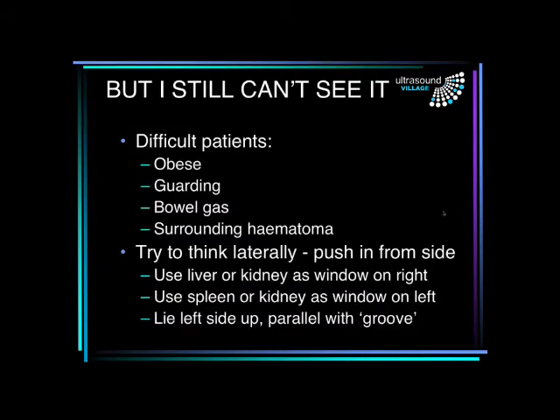Now there are some patients who are very easy — unfortunately, the bigger the aneurysm, usually the easier it is to see. But there are a lot of patients who are actually very difficult. The obese patient will give you trouble. Patients who are guarding won't let you press hard enough to move the gas. Patients with a lot of gas can make it almost impossible to see the aorta. If there's a surrounding hematoma, that can also make it quite difficult. In these cases, sometimes instead of coming in from the front, come in from the side, using the liver or kidney as the acoustic window from the right, or the spleen or kidney on the left.